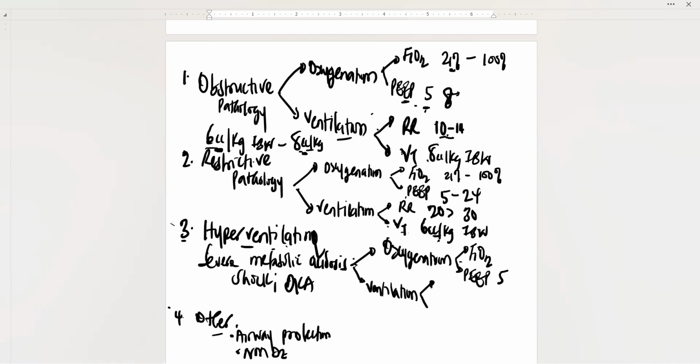for these patients, remember, before even intubating these patients they are hyperventilating, so they are breathing really fast and they are taking big tidal volume, right? So in these patients, I tend to put the respiratory rates on the higher side, usually close to 30, depending on what they're doing before the intubation, and the tidal volume, I also tend to go on the higher side because I'm trying to mimic what they are doing before the intubation. So I tend to give them higher tidal volume, 8 cc per kg of ideal body weight, right?